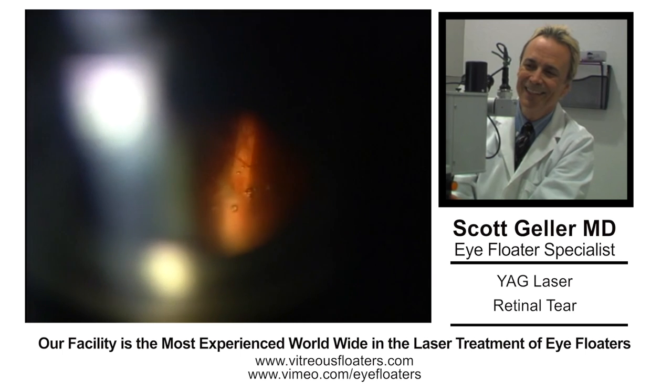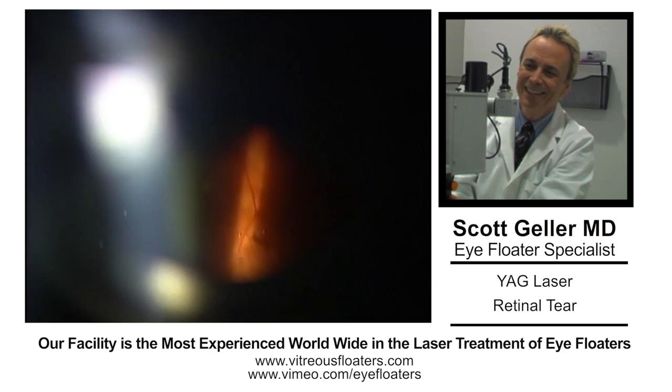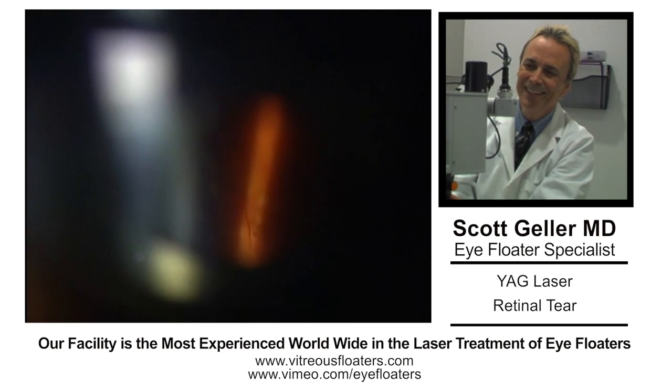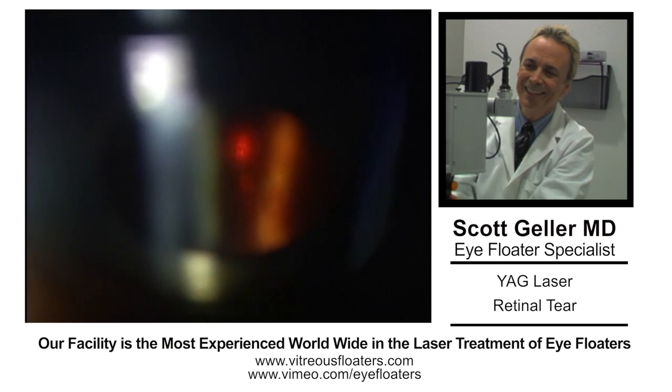So you can see the tag right there. There's a little triangular elevation and there are some vague vitreous strands just pulling on that.